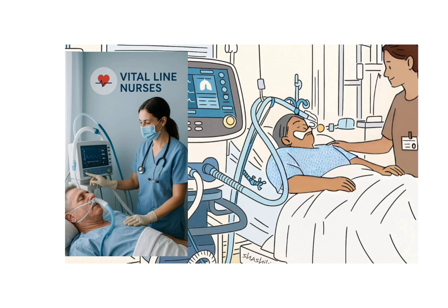2. Prevent ventilator-associated pneumonia, VAP. Provide oral care every 2 to 4 hours. Keep the head of bed elevated 30 to 45 degrees, and use sterile suction techniques.